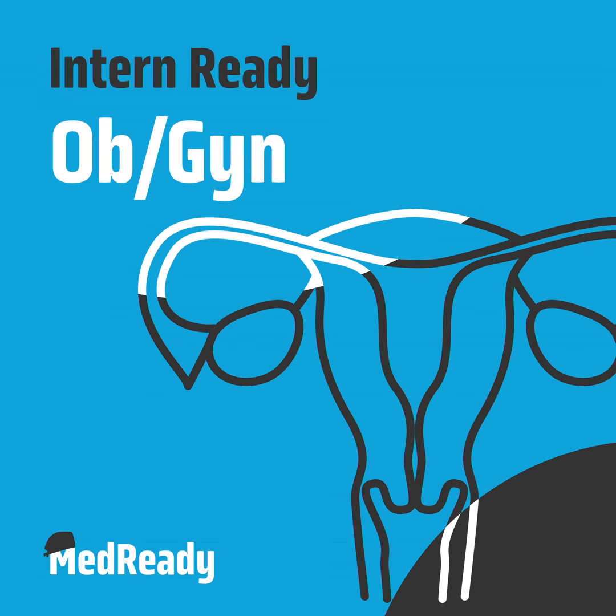Awesome. So starting from the top, why is somebody getting a hysteroscopy in the first place? What are the indications? Yeah, so there are two big categories for hysteroscopies. There are diagnostic hysteroscopies and operative hysteroscopies. A diagnostic hysteroscopy could be done for many reasons. Most commonly is for some form of abnormal uterine bleeding or postmenopausal bleeding, although it could also be used for an infertility workup or abnormal imaging findings.